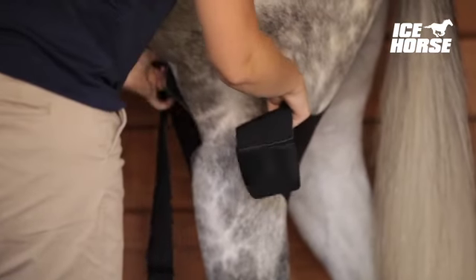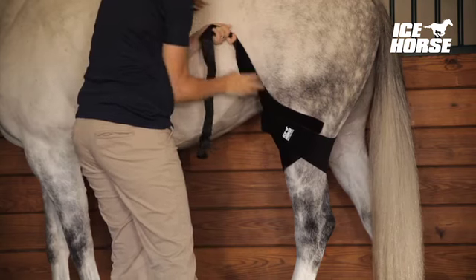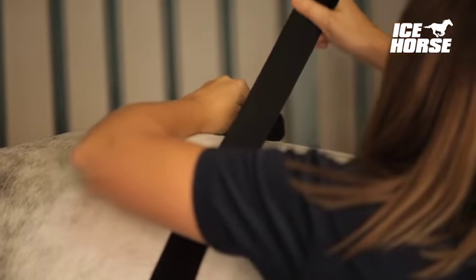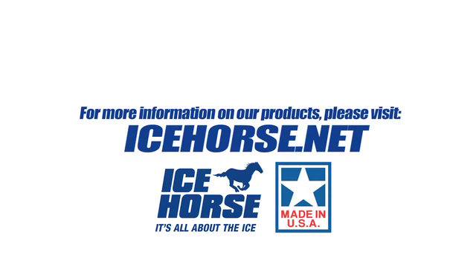Then separate the right and left wrap. Working one side at a time, place the ice wrap against the stifle area. Secure the Velcro straps and place the suspender over the horse's rump. Repeat the process on the other stifle and fasten the suspender straps together. Icehorse — it's all about the ice.